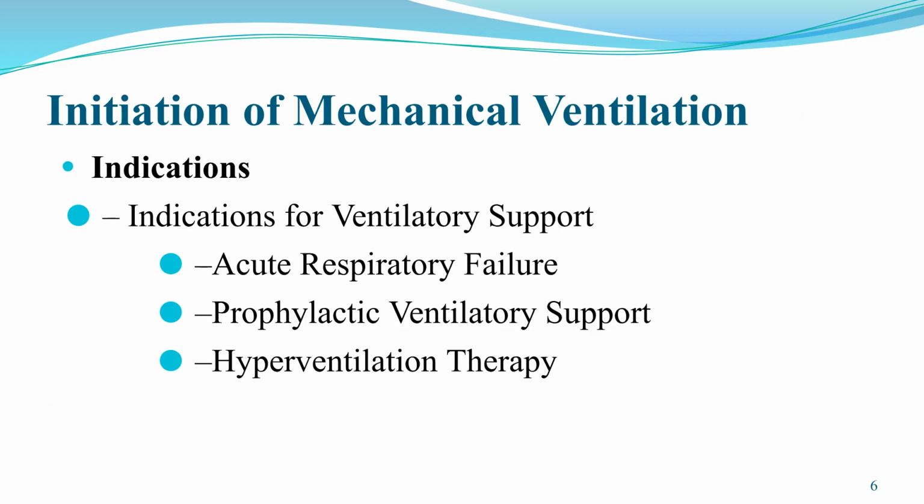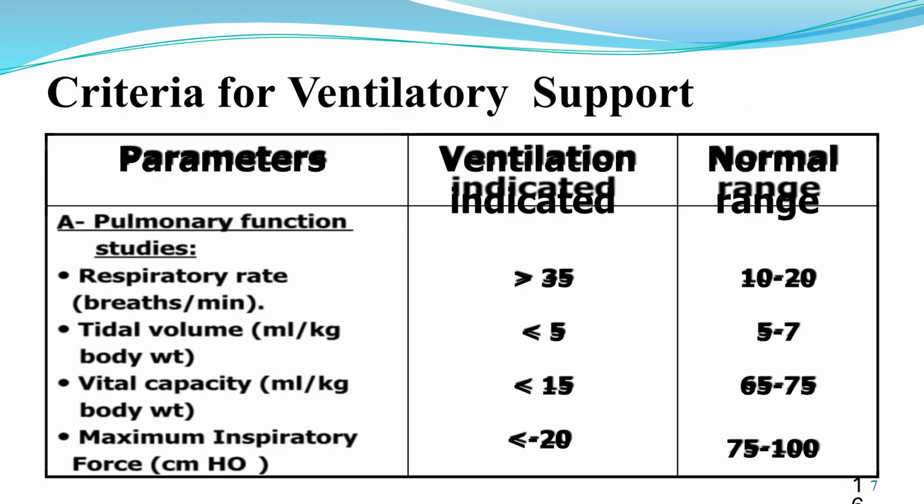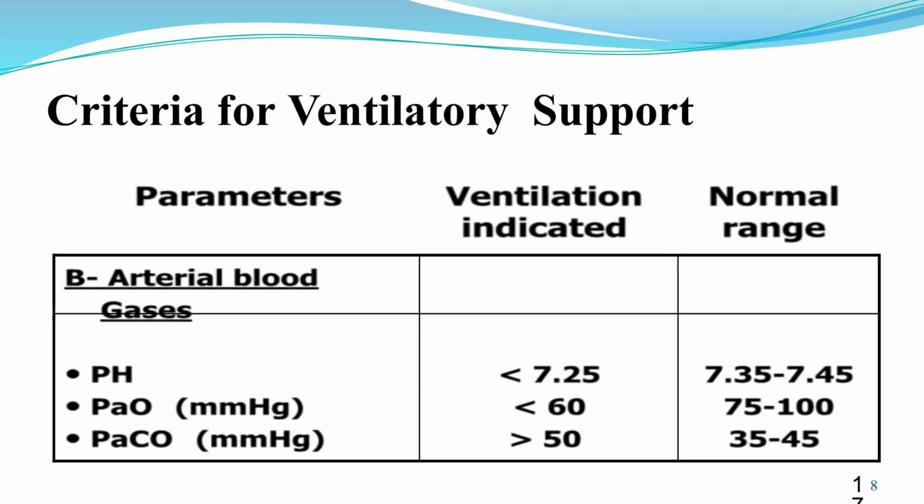Indications for initiating mechanical ventilation include acute respiratory failure, prophylactic ventilatory support, and hyperventilation therapy. Criteria for ventilatory support, based on pulmonary function studies, include respiratory rate greater than 35 breaths per minute, tidal volume less than 5 milliliters per kilogram body weight, and vital capacity less than 15 milliliters per kilogram body weight.